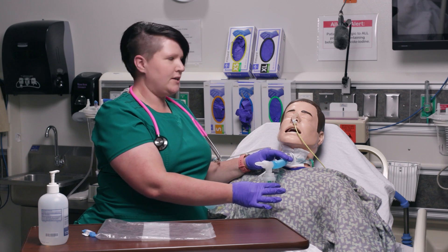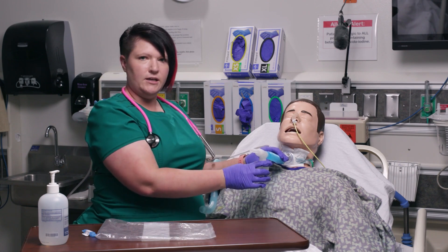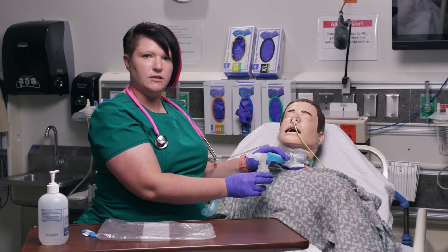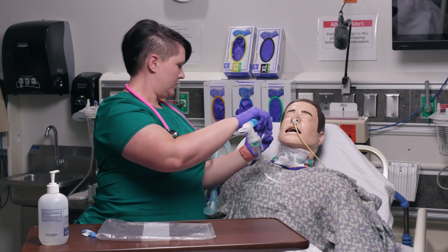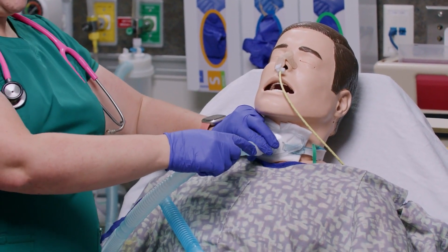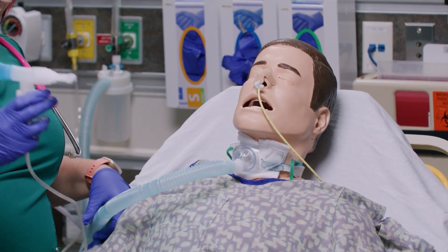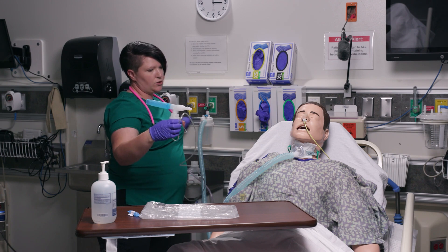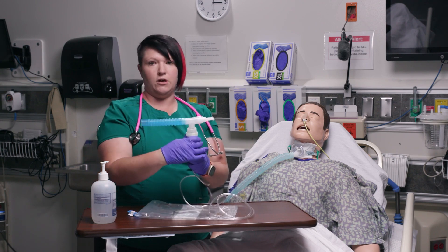The nice thing about patient beds is there's oxygen on both sides. We have oxygen set up on this side for the trach oxygen mask, and oxygen on the other side for the nebulizer. I'll follow the same exact process giving the medication through the trach. After 15 minutes I'll disconnect and reconnect the corrugated tubing back to the patient's trach so he can continue to receive the oxygen he needs, returning him to his normal oxygen level.